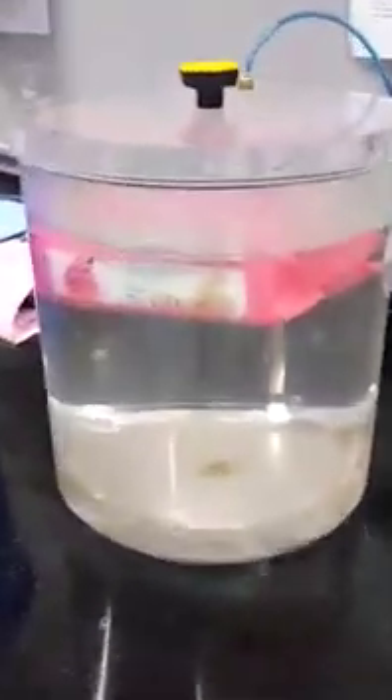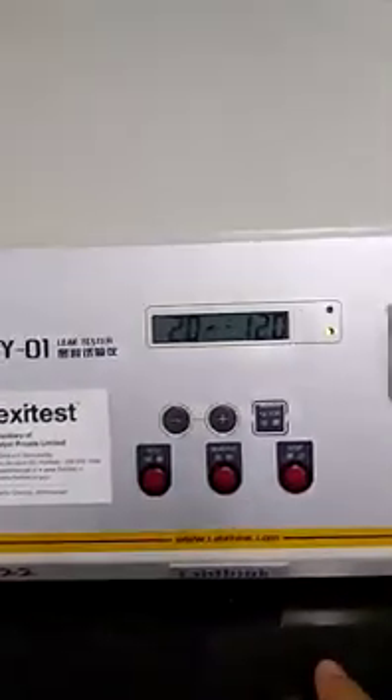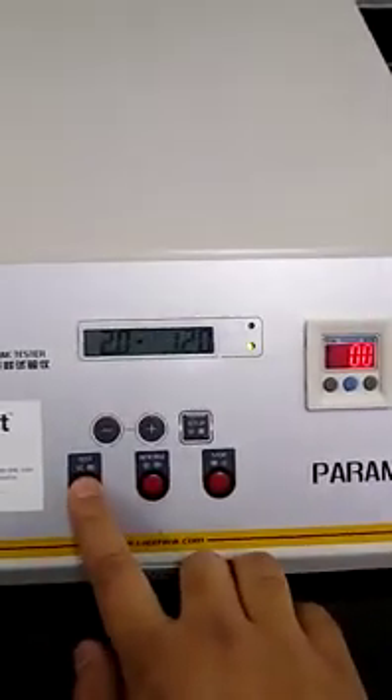This is the current vacuum in the desiccator. Inside it there is a baby wipes package from Johnson & Johnson, containing 80 wipes inside. Now I will press the test button.